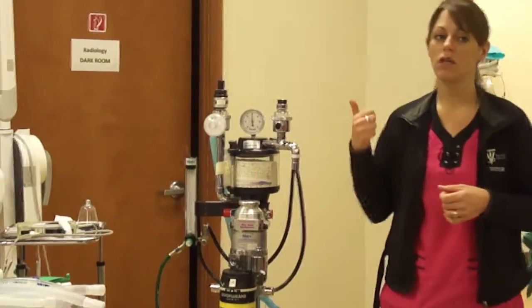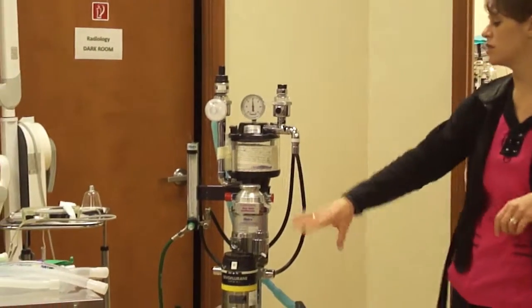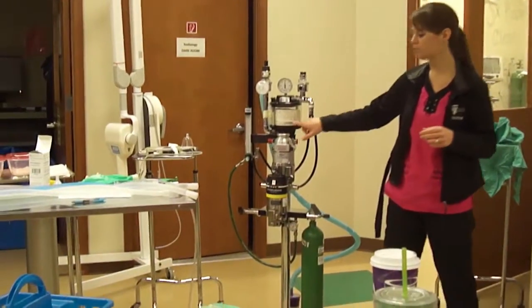Now, you don't need to include anybody on a non-rebreather, because with a non-rebreather the gas does not go through the canister. So only patients on the rebreather system. And they're going to write down the total time.